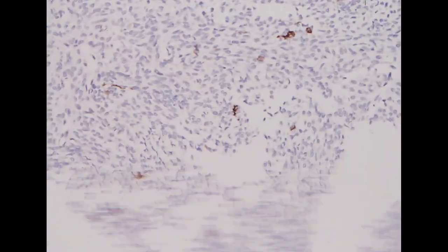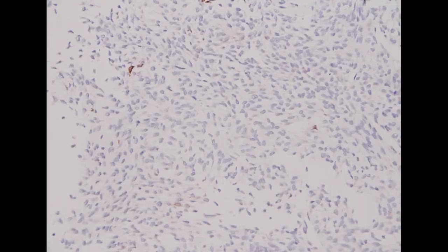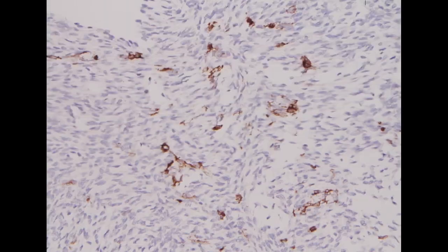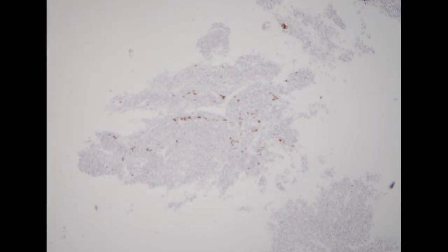This used to be one of the most helpful markers for correctly identifying synovial sarcoma. So you see this scattered CK staining pattern. So we will sign out this case as a synovial sarcoma because we have the confirmatory immunohistochemistry.